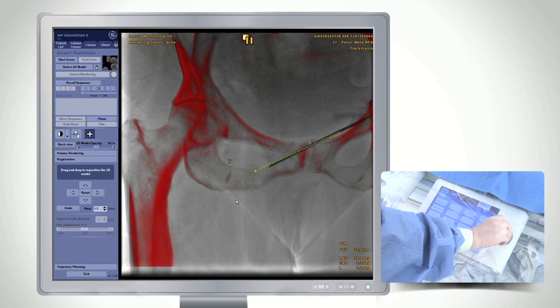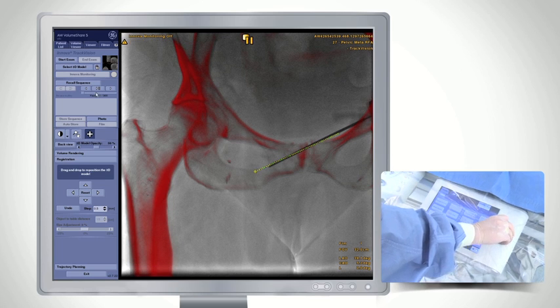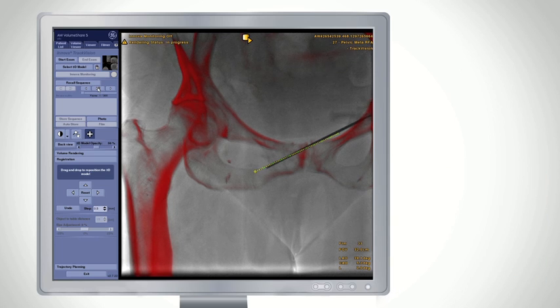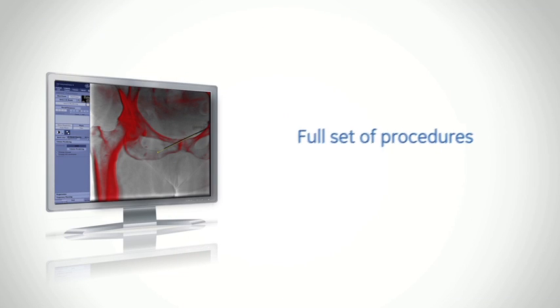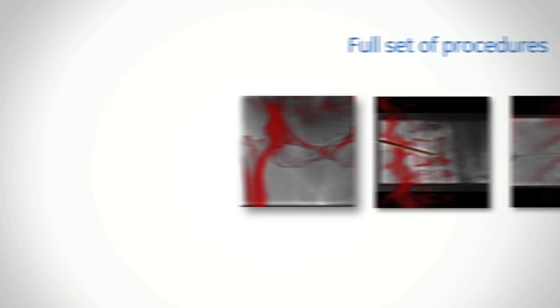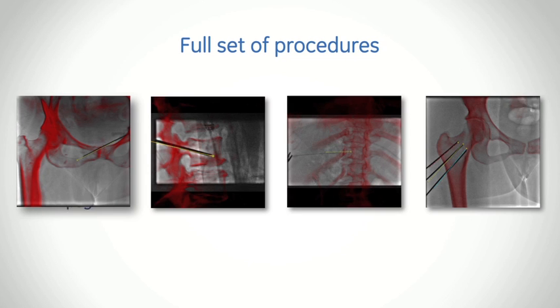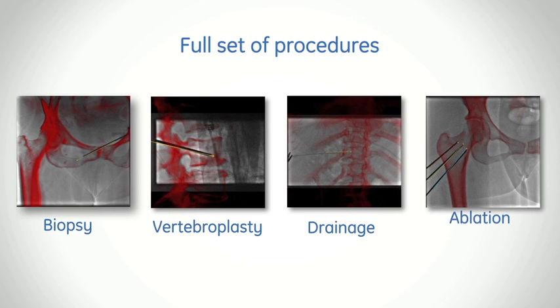Innova Track Vision allows you to advance your needle down a planned trajectory and visualize any deviations from the desired path. You can use this live 3D guidance solution for several clinical procedures, from biopsies and vertebroplasties to drainages and RF ablations.